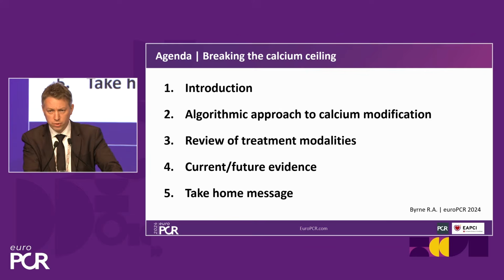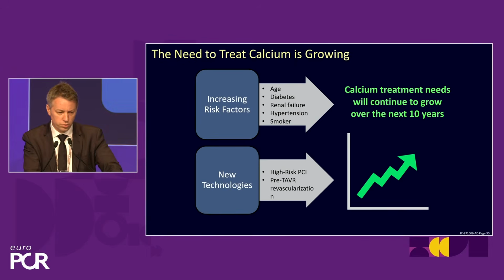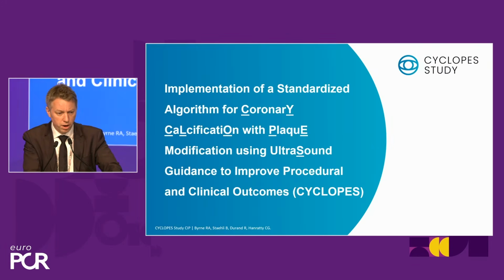Look, I want to show you a new algorithm, the Cyclops algorithm for calcium modification, review briefly the treatment modalities, and a word or two on current or future evidence. The reason we're here is the growing need to treat calcium. We know this is due to the constellation of risk factors, the age of the population, but also on the positive side, we have an increasing armamentarium of devices with which to prepare calcium.